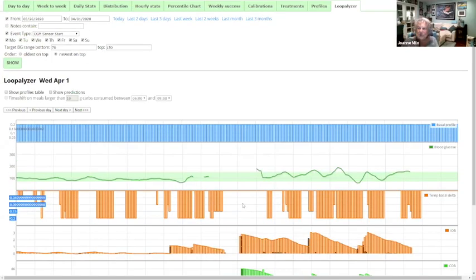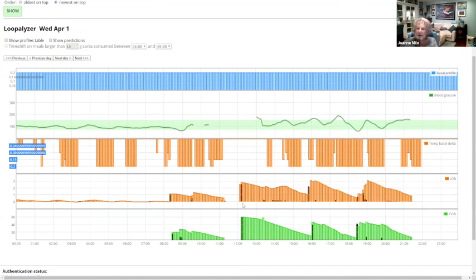So two more questions. One from Carrie's Mac, so I guess that's Carrie. I'm looking everywhere for a way to see a report that will print out the food and emojis so that I can keep a record or copy it into Excel. Yeah, not gonna happen. I've tried to.